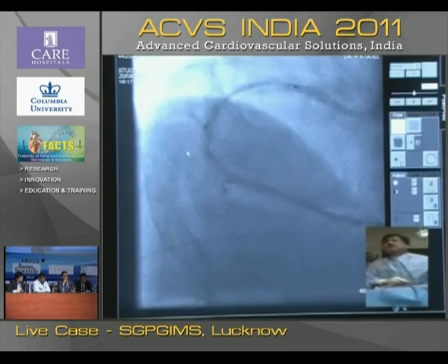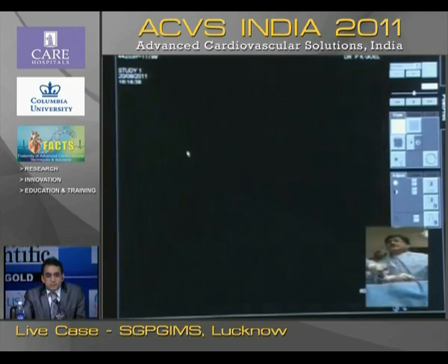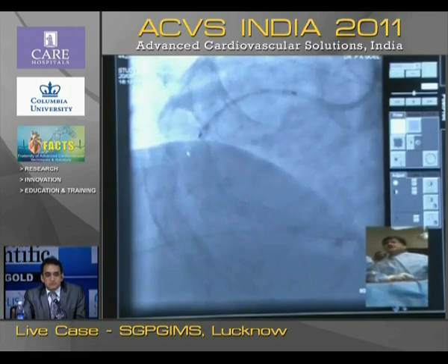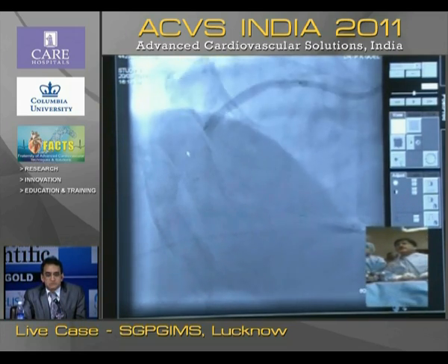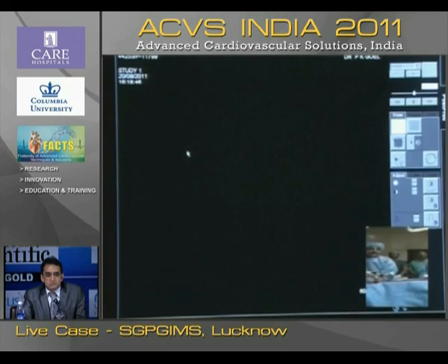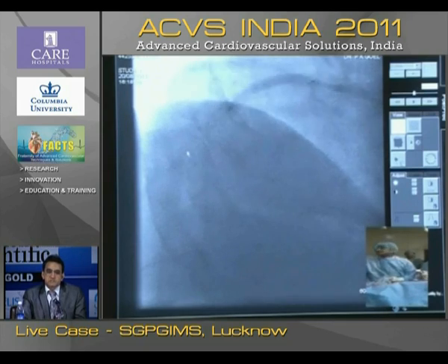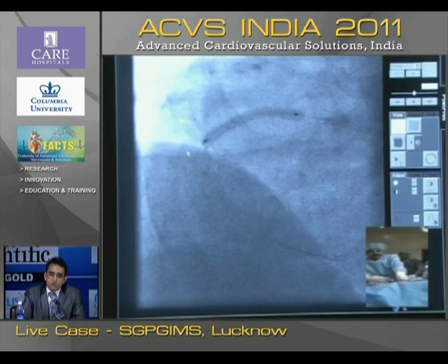Yeah, when you go slightly higher on the pressure, you can pull it. Right. Yeah, now you pull the guide out. Yeah, there was a problem, you know. No, that's fine now. Your stent may be a little short, that I don't know, but I think it's okay. It's now properly implanted.